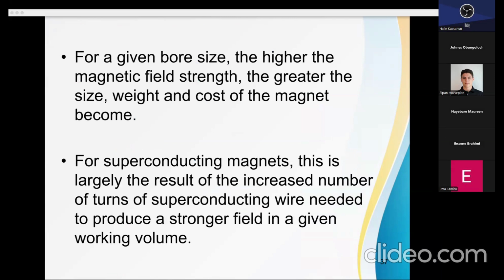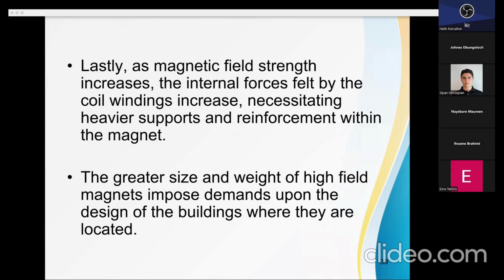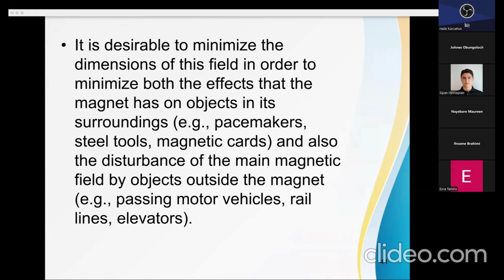Siting considerations, we are not going to talk about that much. We want to go to the rest of the magnets that we have. But as you can imagine, depending on the type of magnet that you have, where you locate it also matters quite a bit, okay?